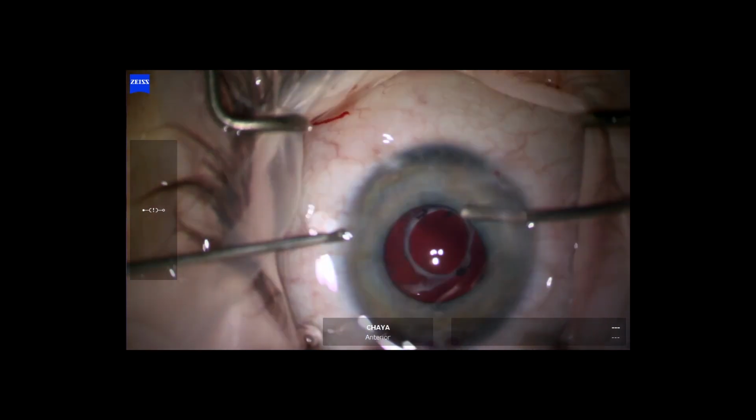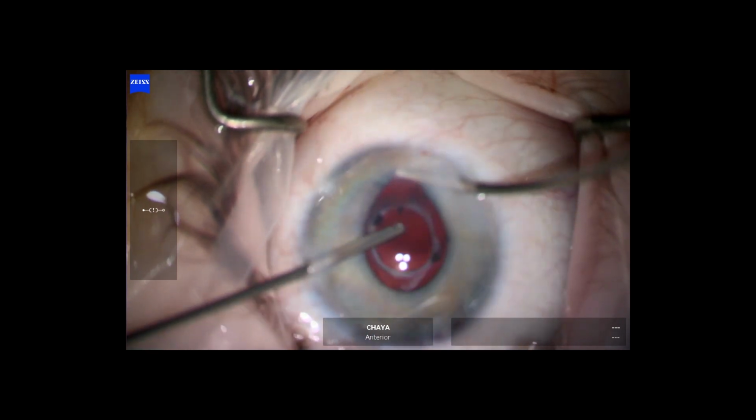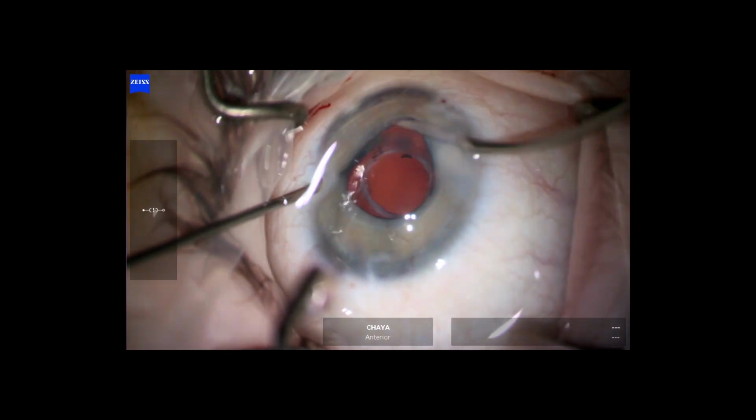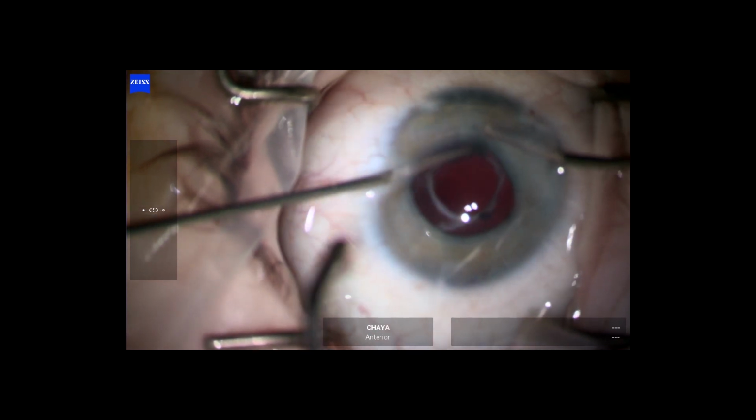It is important to try and remove as much of the Sommerings material as possible, as it can stir up a severe inflammatory response once it has been liberated from the capsule. However, there may be areas where there is fibrosis of the capsule, and I typically will leave these alone as these provide structural support.